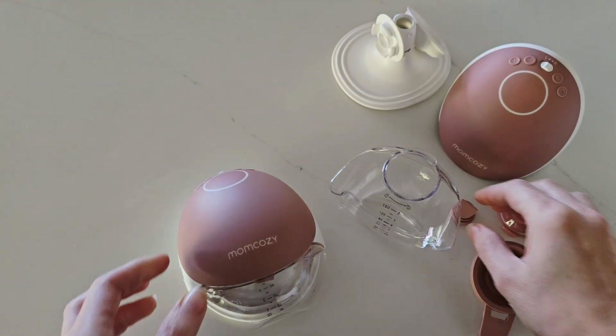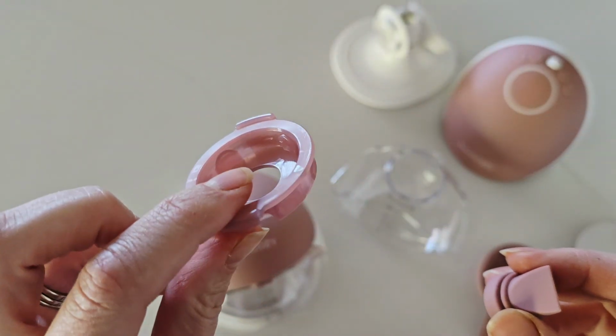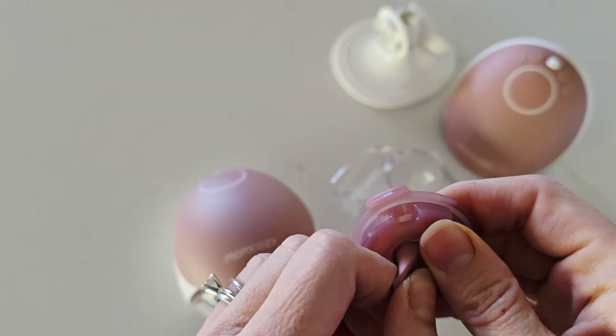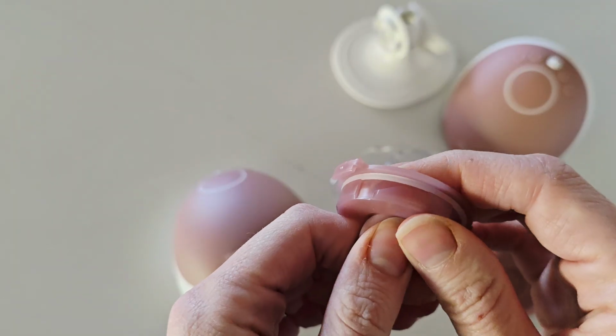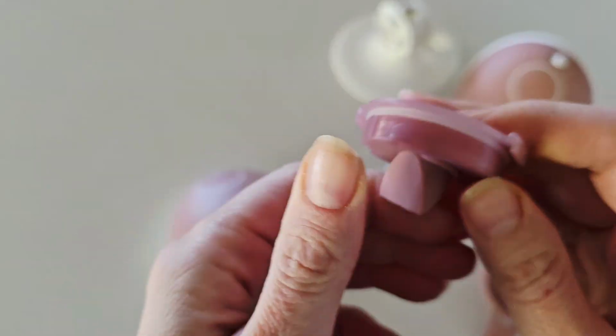And we'll start with your valve setup. So you have your duckbill valve along with its lid. Now this actually comes as a combo when you are buying the original Momcozy replacement parts.